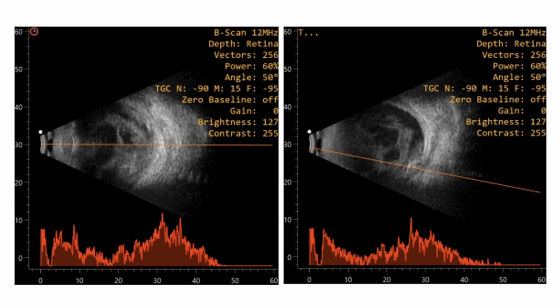So the ultrasound was done in this case. Ma'am, the ultrasound shows one definite lens echo along with multiple dot and clump echoes in the vitreous cavity. The inferior scan shows one localized high reflective membrane echo with some retinochoroidal elevation at that point.